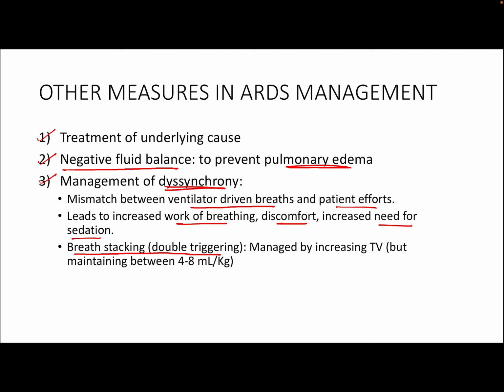Now this leads to what we call an increase in auto PEEP, an increase in the alveolar pressure because of all that stacked up air. That is called auto PEEP. Now, why would this happen? The reasons this could happen is because the second breath is taken too soon, with less time for the first breath to completely exhale.